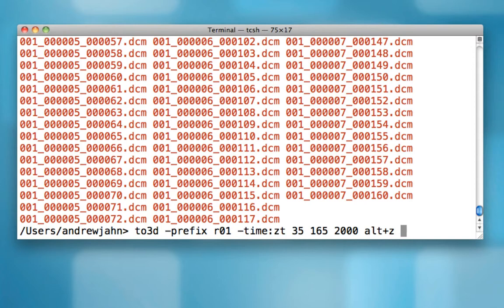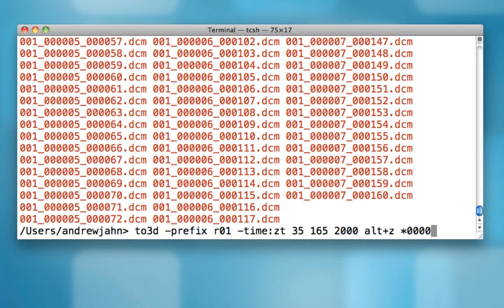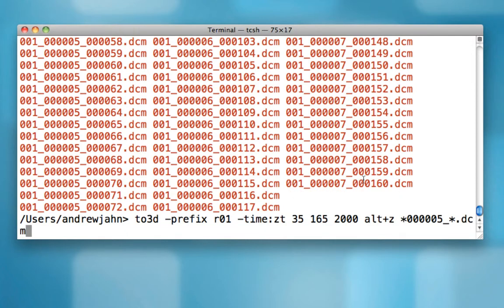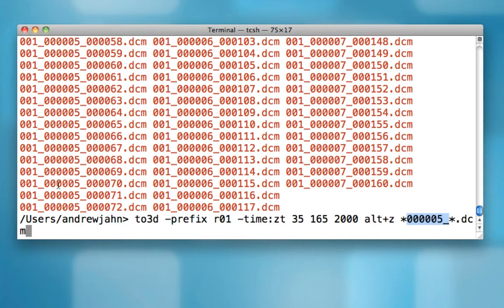The last input that to3d needs is the input, so all of these different DICOM files. Now, instead of listing them all separately, we can use Unix's wildcards. So this wildcard will grab one or more characters. And then we only want those DICOM images unique to run 5. So here I'm going to type five zeros and then a five underscore another asterisk to grab one or more other characters and then .dcm. So think about these wildcards as being a kind of filler and they can be anything, but it's only going to grab those files which contain this pattern, which is unique to run number five.